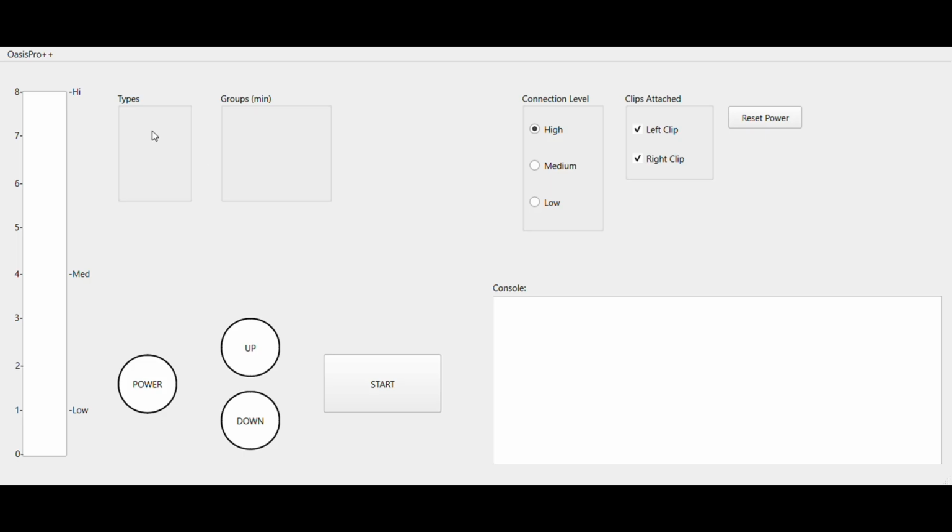Basically, what you're looking at is the GUI here, and this is to simulate a medical device. The device itself would be a shock therapy device where you would connect these clips to your earlobes, your left and right, and administer like a small shock over time that's supposed to have relaxing effects. So this GUI replaces that physical device, and it's kind of a simulation where you could test the software to make sure everything's working correctly.